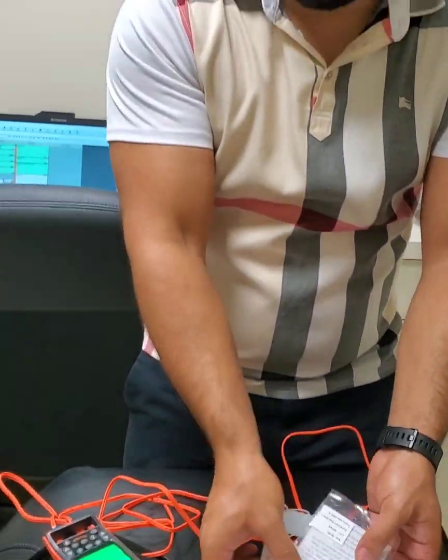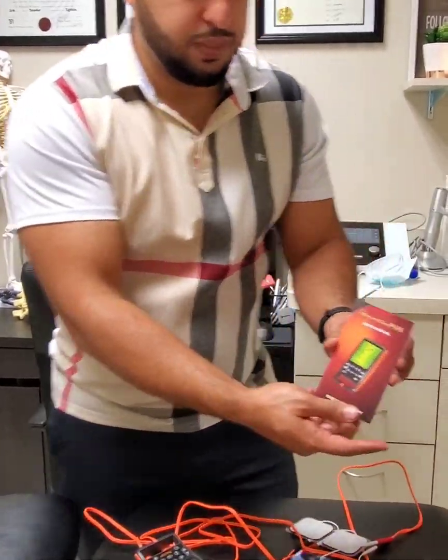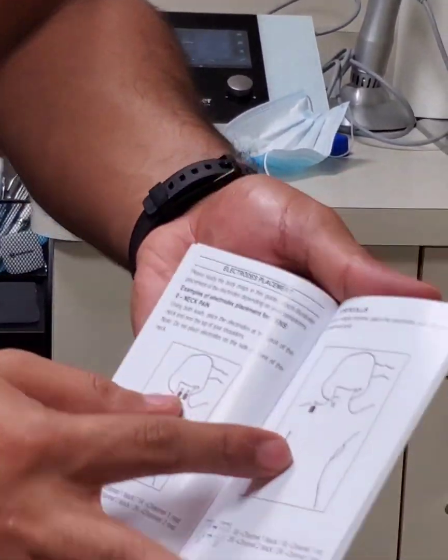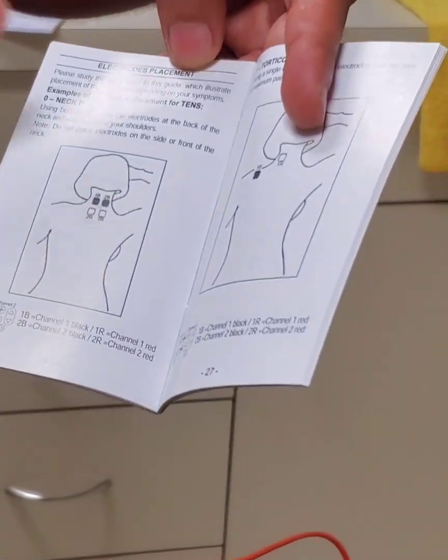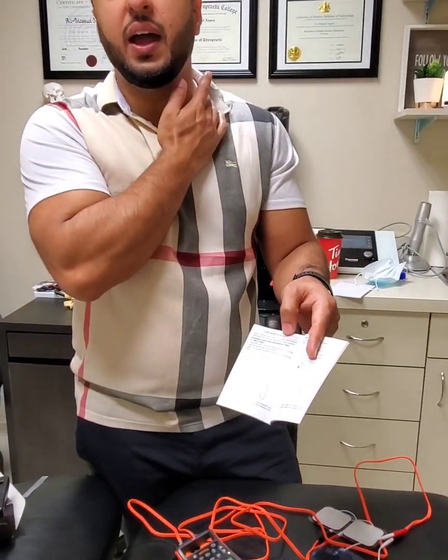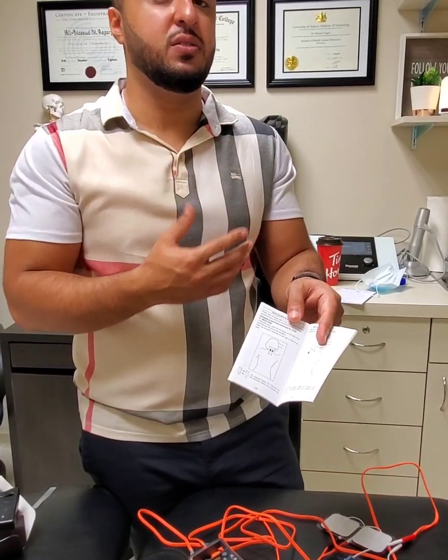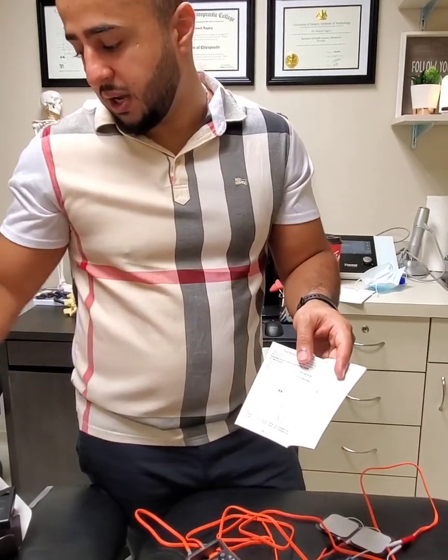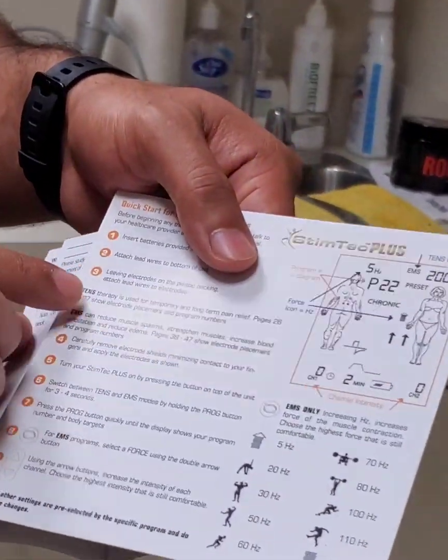Before you turn it on, I want to show you how to place these pads and where to place them. You're going to open up one of the books in the kit — one's in French, one's in English. As you open this book and slide past the first page to page 26, it's going to show you the difference between the TENS setting and the EMS setting. TENS is more for long-term and short-term pain relief — I advise using that for areas like your neck, back, or any joint issues to decrease pain. The EMS setting is more for muscle pain — if you have muscle spasming or want to increase blood flow to the region, you're going to use the EMS setting. The book explains the difference between TENS and EMS so you can read more about that.